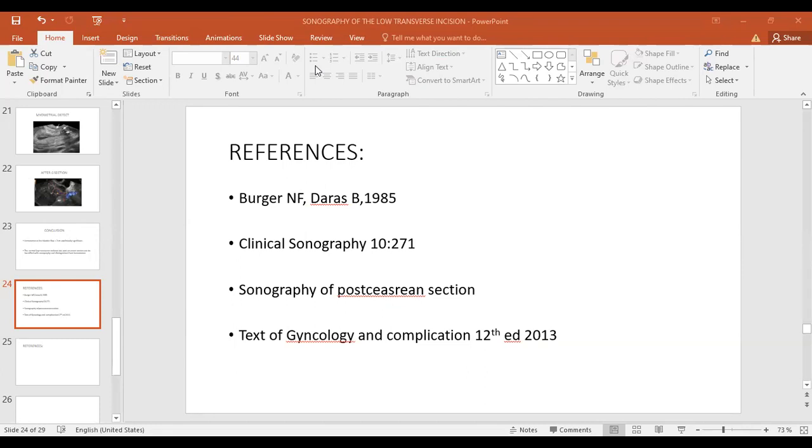I don't think my question is clear. Okay, so in short, if I've gotten you right, you are trying to relate the cyst which was found, maybe was it on the right or on the left, to the ectopic pregnancy which was found? Yes, because the patient came 3 weeks after the operation with abdominal swelling. So they were trying to rule out hematoma, but the patient was very stable. The only thing that was there was a cyst. The initial diagnosis was trying to rule out a hematoma, which we never found.